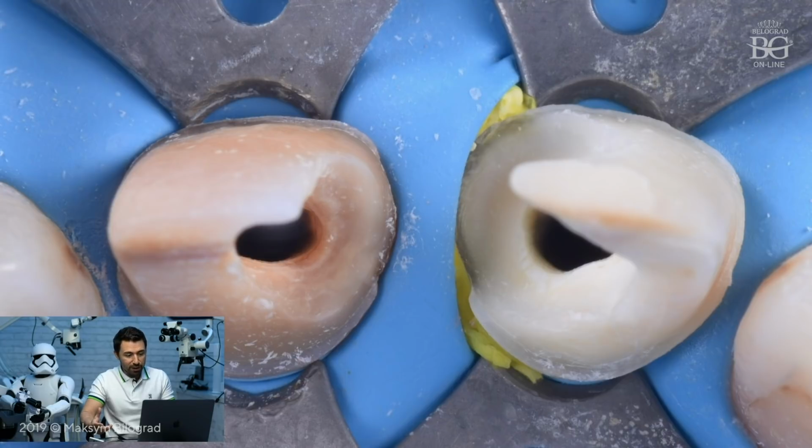And I really love this picture because it shows how clean the tooth is after removal of the caries. It has to be super clean from the caries lesions. And then you see the substrate for bonding is good, the dentin is good. Everything is perfect to get some bonding of your build-up material.